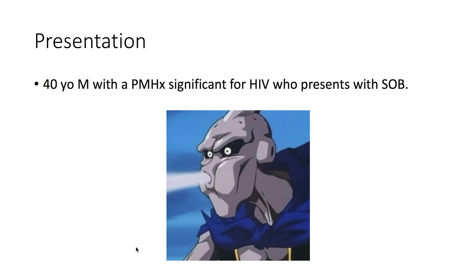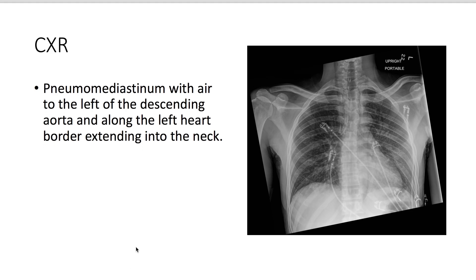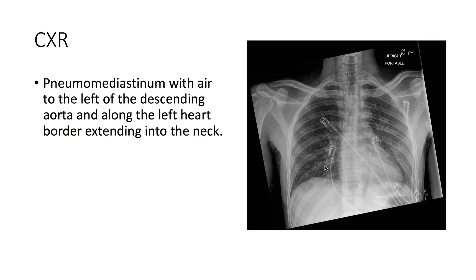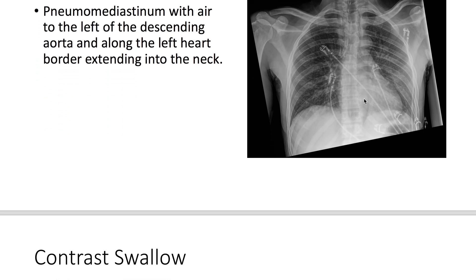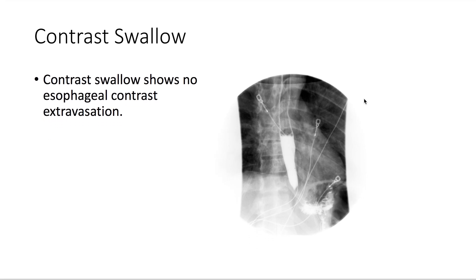For the presentation, we have a 40-year-old male with a past medical history significant for HIV who presents with shortness of breath. Taking a look at the chest X-ray, we note that there's a pneumomediastinum — there's air on the left along the descending aorta and along the left heart border. This air tracks upwards and towards the neck.